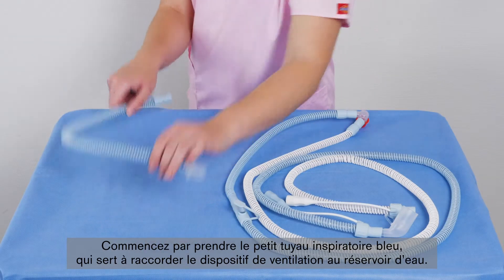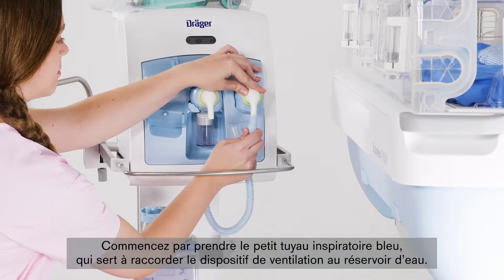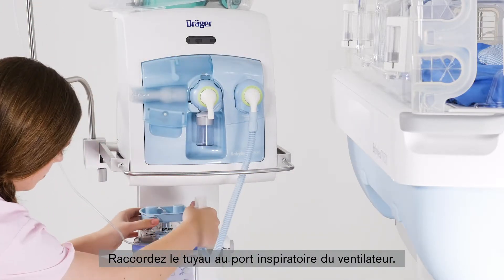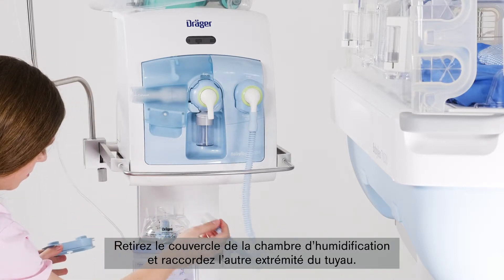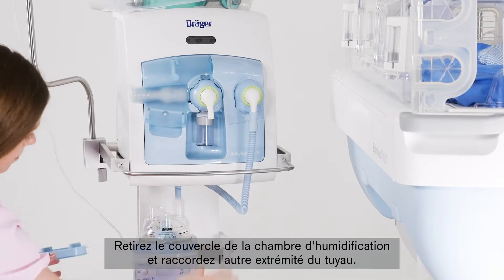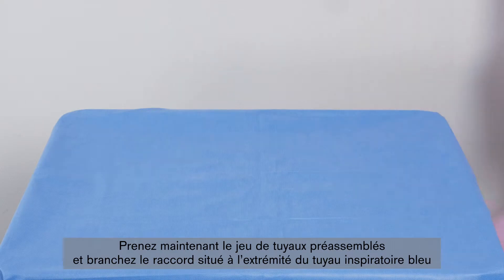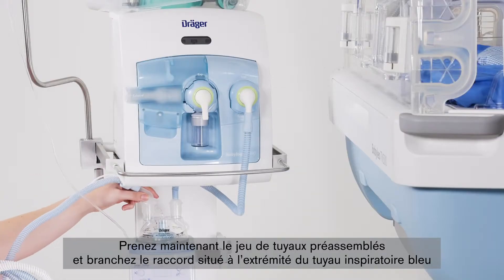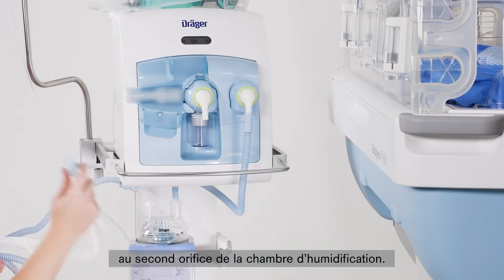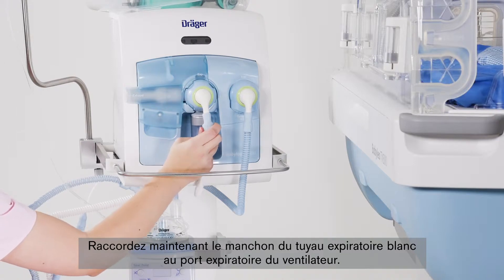First, take the short blue inspiration hose, which serves to connect the breathing device to the water chamber. Connect the hose to the inspiration nozzle of the breathing device. Remove the sealing cap of the humidifier chamber and connect the other end of the hose. Now take the pre-assembled hose system and connect the connector at the end of the blue inspiration hose to the second opening of the humidifier chamber. Then connect the sleeve of the white expiration hose to the expiratory nozzle of the breathing device.